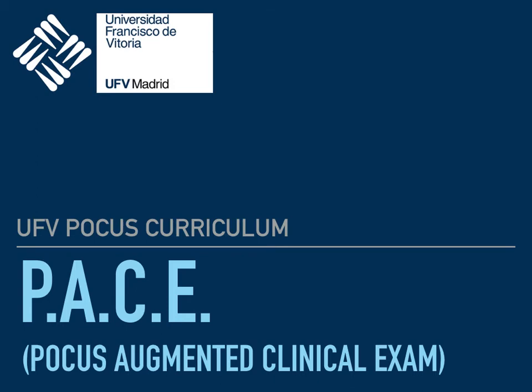Hello everyone, welcome to this seminar in which we are going to use ultrasound to enhance or to augment the clinical exam and how to use it in different clinical scenarios.